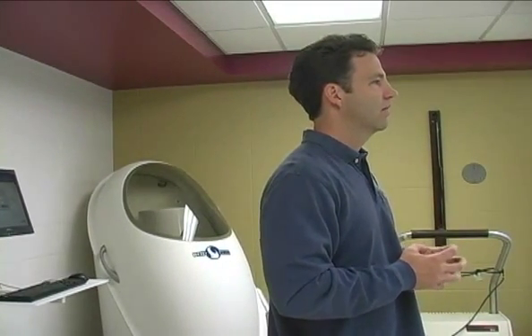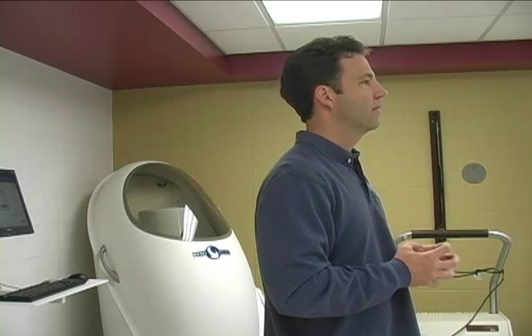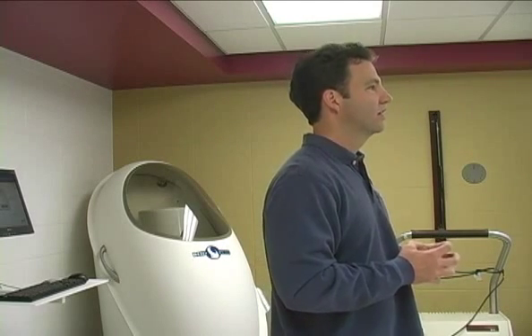Yeah, it does. So if you were to say, of the methods, which are the most accurate at this point, which would be now comparing the closest to like actually dissecting somebody and actually measuring all the fat, how would you rank the methods? It depends on which researcher you talk to, but from what I hear and from talking to researchers, it's either the BOD pod or underwater weighing.